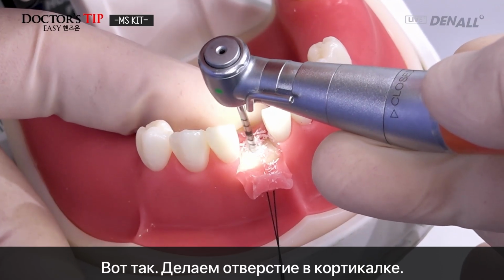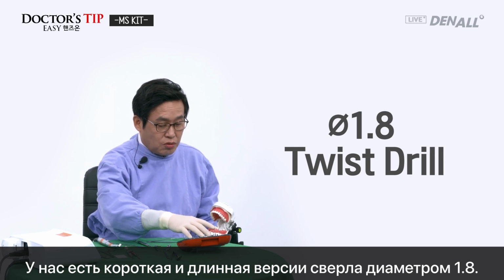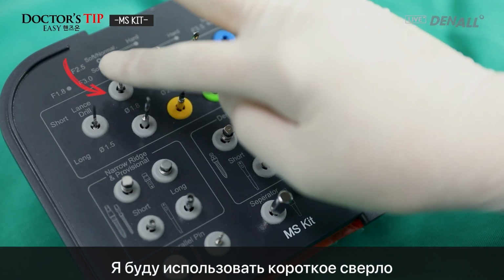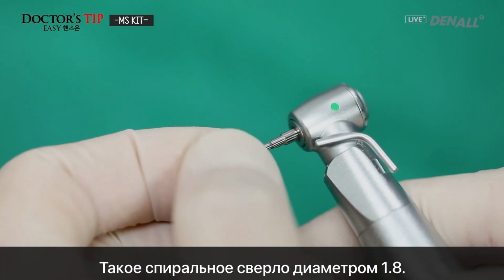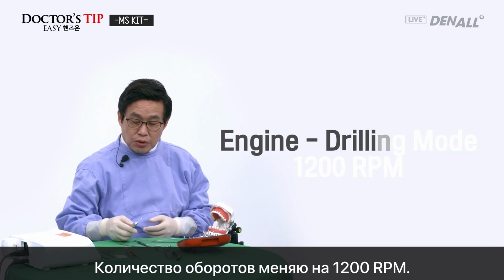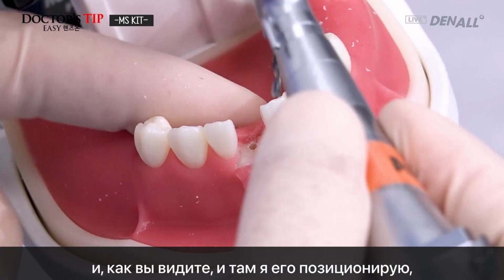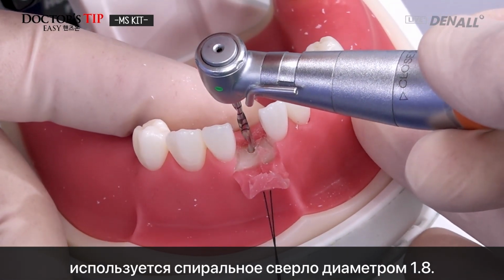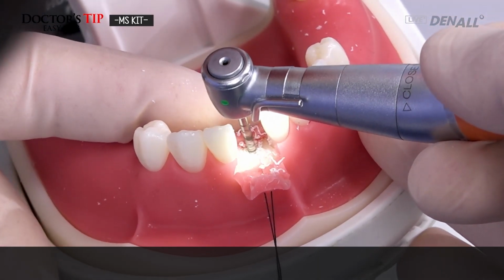put a hole in the cortical, and then the 1.8 diameter twist drill. You have short and long versions. I will use the short for my first drilling. So the 1.8 twist drill, like this. RPM, I changed to 1200. And as you can see, in the area I placed, I position it, and the diameter 1.8 twist drill is used.